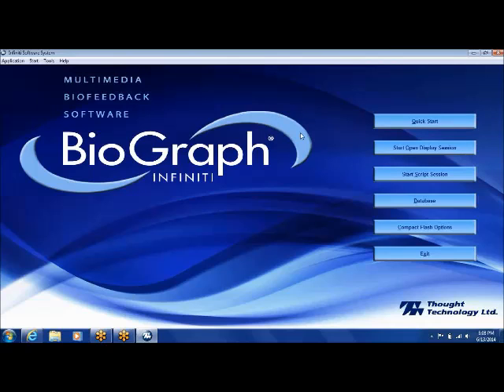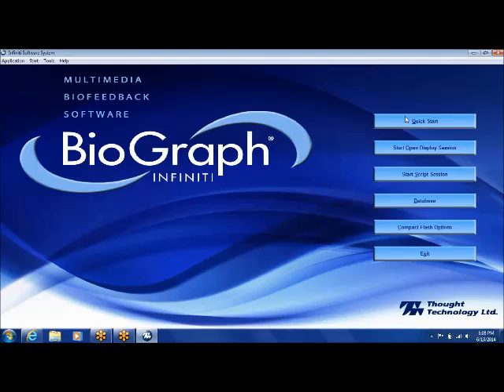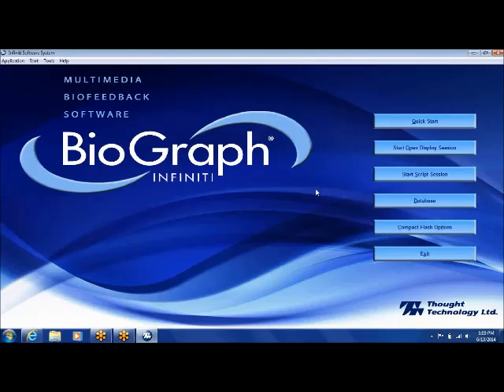When I'm introducing someone to using the Biograph software, the first thing I usually do is have them go to quick start. There are basically three ways to run the program: you have your quick start button, your open display session, and your start script session. The two real ways of running the software are open display session and script session. Quick start is a shortcut way of doing either of those two things.